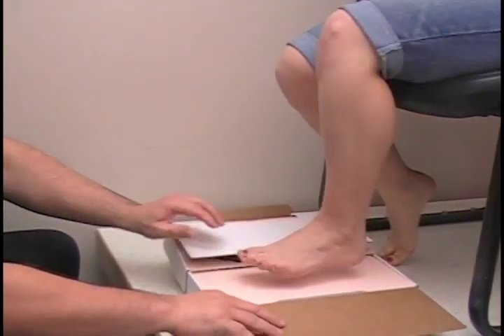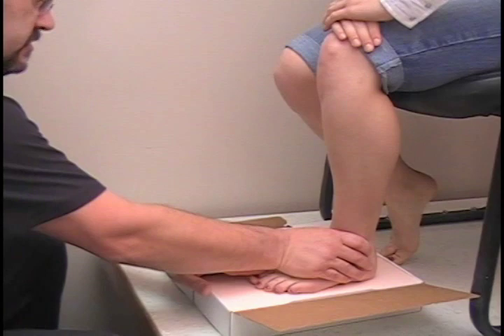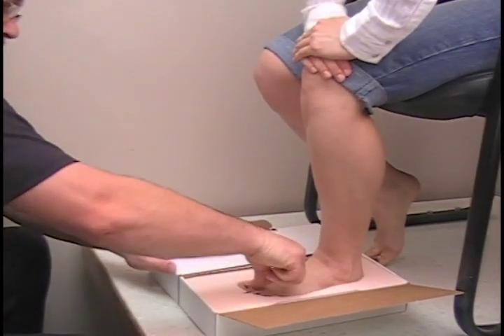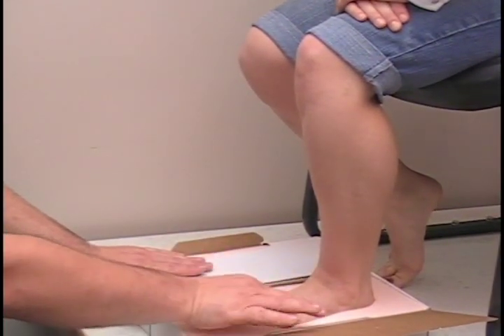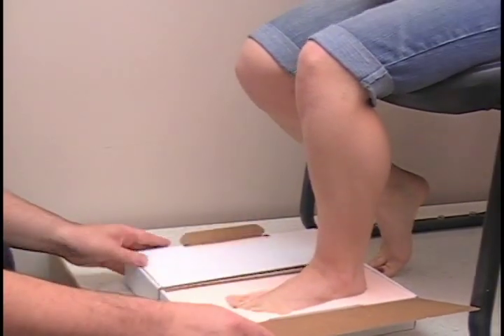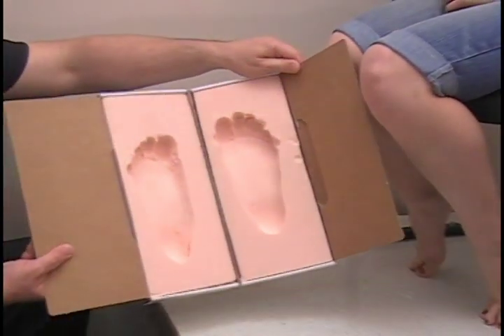The other side is just as easy. Next, turn to rotate, grab the arch. Count of three — one, two, three. Three quarters of the way down. Push the toes down. You want to make sure your first and fifth are pretty even. If you need to push them down a little bit, just push them down just slightly. Go ahead and pick that up. And that's my completed package right there.